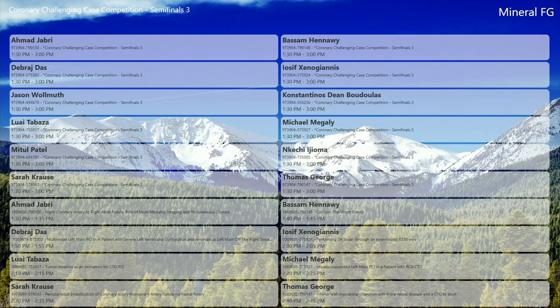Yeah, and that's going back to, I think you mentioned it, the right heart cath. If you're worried about RV failure, because their mortality from the SHOCK original trials is just as high as with LV failure, get right heart cath hemodynamics. And one thing we've learned, at least in our practice, is we tend to go back to the floor, we watch, we look at the numbers, we wait, and then when we go to put the RP Impella in, it's too late, and they're spiraling, and they don't survive. So be proactive and move quicker rather than later, and I think we're starting to learn that the hard way, at least in our institution.